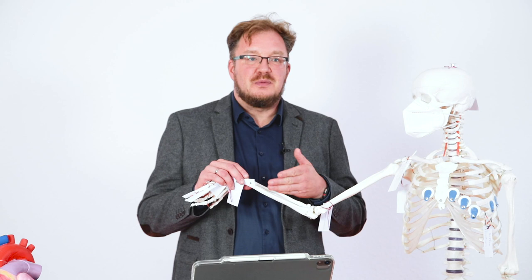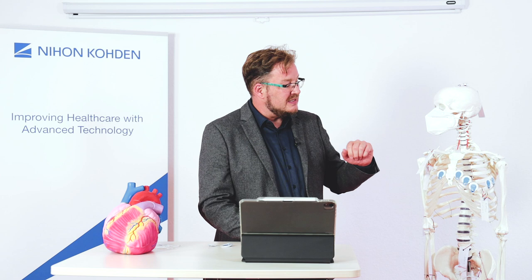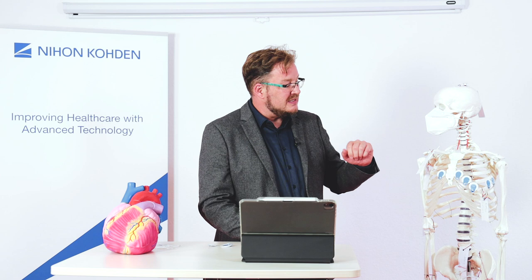For the extremity leads it is not so difficult. On a regular basis we place them on the extremities, but to make it easier in a pre-hospital setting we can use the connection points of the extremities. You can place them over the joints, over the bone, over the muscles. There are a lot of discussions about what is the best spot. I like to use the bones because you have no interference from muscles. You have to place the extremity leads at least ten centimeters away from the heart — that is the minimum.